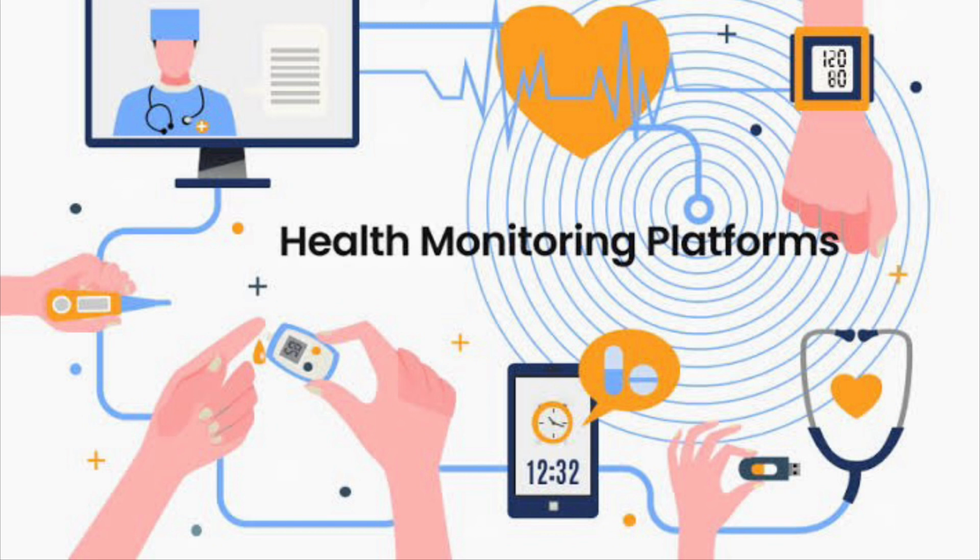Thirdly, most of the patients are worried and they want to know about their vital signs status, whether it is within the normal range or above normal. If it is in the normal range, it can be quite reassuring. And lastly, there is an escalation that happens immediately, because when the blood pressure or some vital sign is elevated, it needs to be escalated immediately, and the nurse will have to find a solution to the problem.